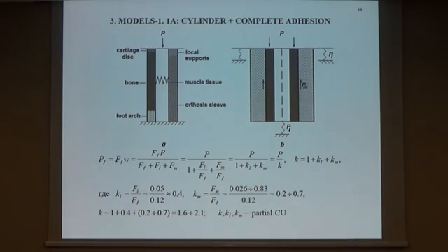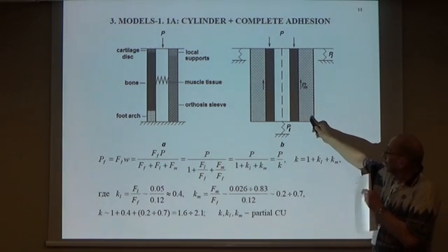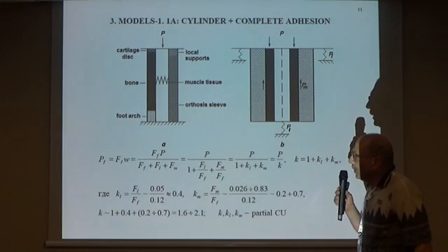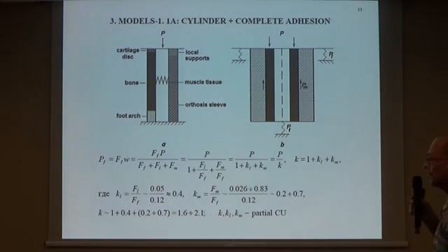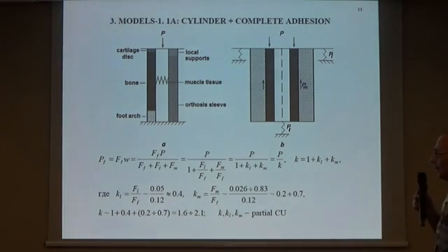P is the body weight. This is the tubular bone. This is the orthosis itself, and this is muscle tissue. That is local supports. Formalizing of this model and calculating the coefficient of unloading gave the result given below. PF is the part of weight falling on the foot, and K is the coefficient of unloading. Assessments give for K the results 1.6 to 2.1.